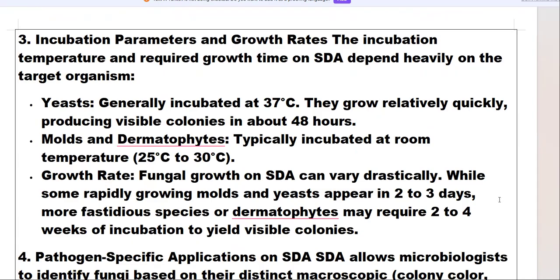Incubation parameters and growth rates. The incubation temperature and required growth time on SDA depend heavily on the target organisms. Yeasts are generally incubated at 37 degrees and grow relatively quickly, producing visible colonies in about 48 hours. Molds and dermatophytes are typically incubated at room temperature, 25 to 30 degrees.